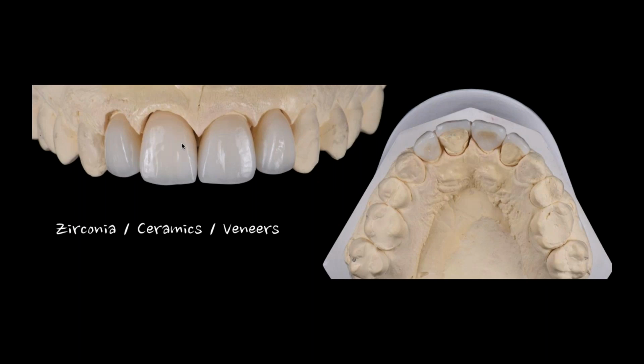It wound up being 2 full coverage, zirconia backed. I used a more opacified zirconia at the time. It was the whiter zirconia from VITA, the opacified version. Today I'm using more of the ST. And then feldspathic veneer is next to it. So you can see how that worked out restorative wise on the cast.